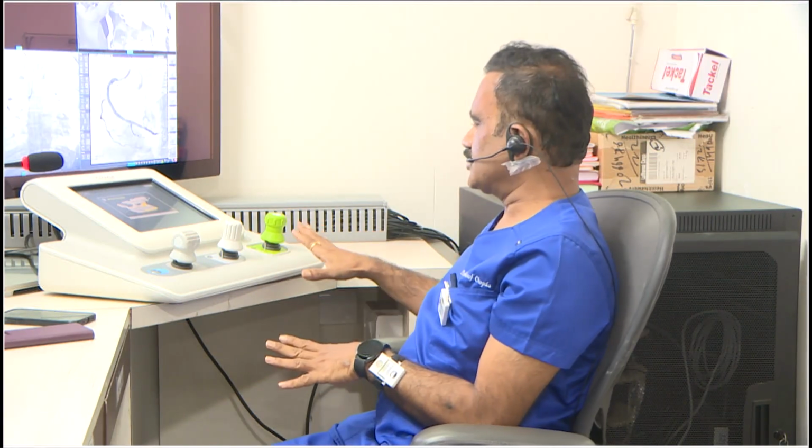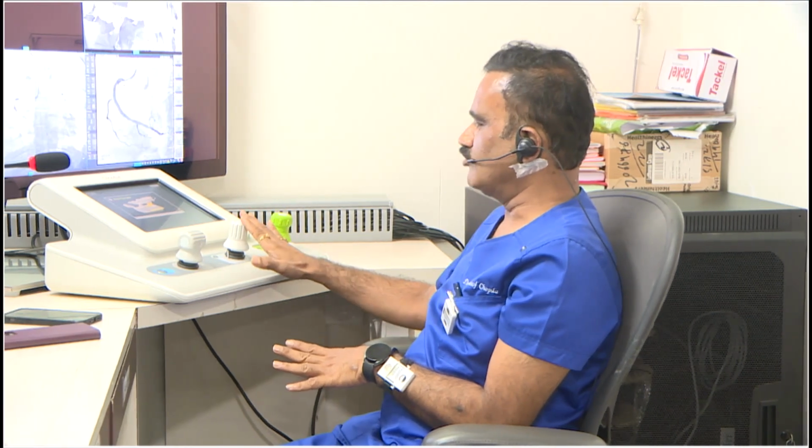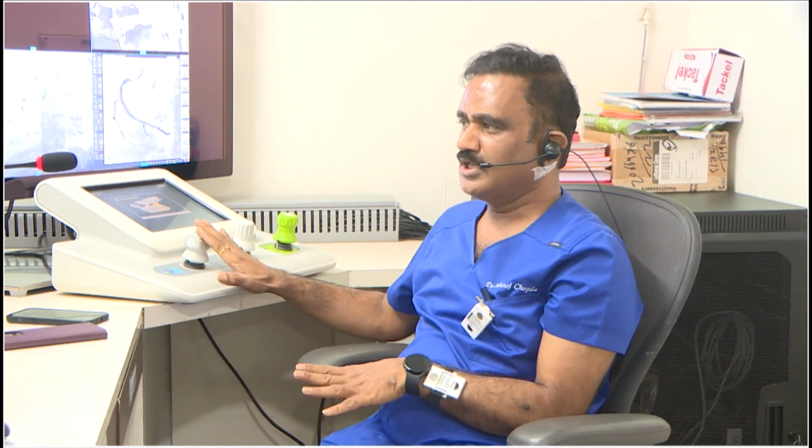And this is how we could do the RCA CTO with a robotic arm, and you could see how we demonstrated the console, 3 joysticks, guide catheter movements, wire movements, balloon and the stent movements, and that's how we are regularly doing angioplasty with robotic arm help. Basically, most important thing is I can sit here and do my procedure completely.